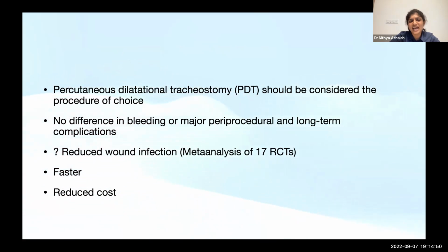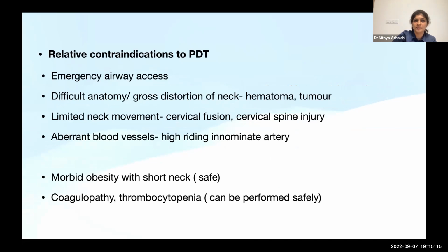Some meta-analyses have shown that there is reduced wound infection in patients undergoing percutaneous dilatational tracheostomy. Also, because this is done at the bedside, it can be done faster, and the cost of percutaneous tracheostomy is lower in most institutions compared to surgical tracheostomy. So these are the advantages of percutaneous dilatational tracheostomy.